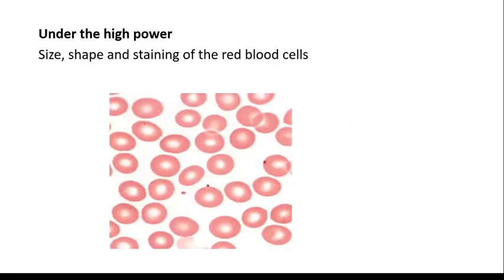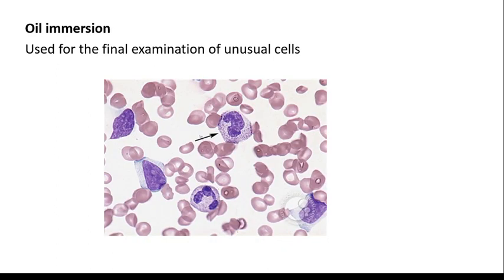Scan the slide under high power to detect size, shape and staining quality of the red blood cells. Oil immersion is used for the final examination of unusual cells.